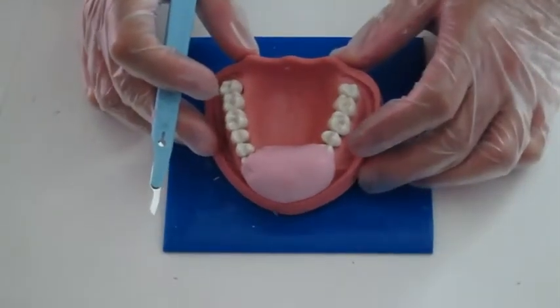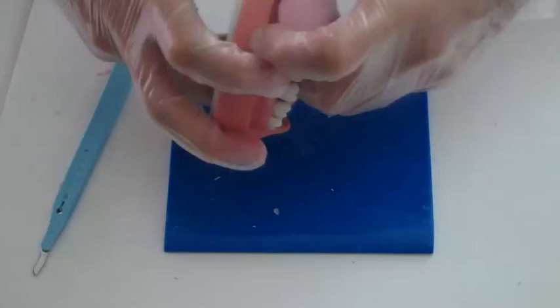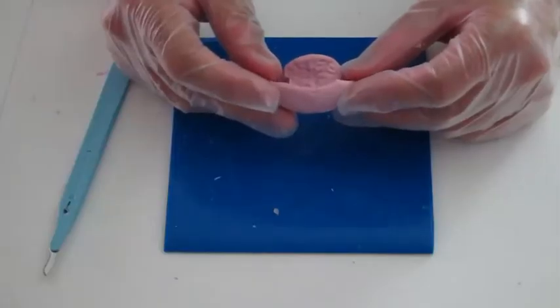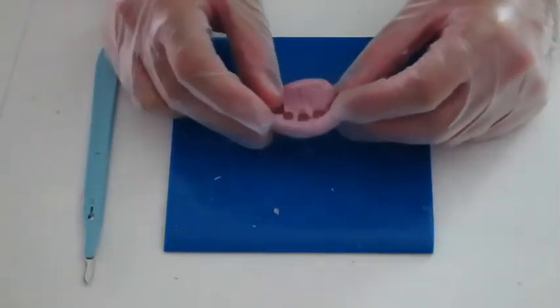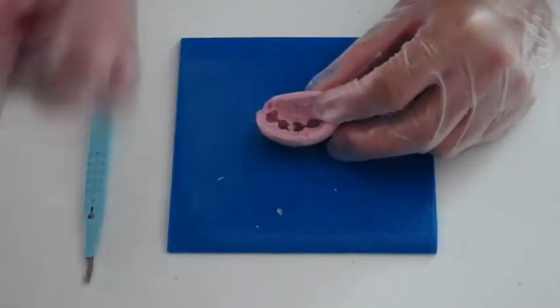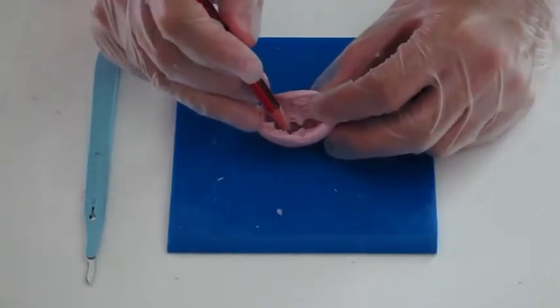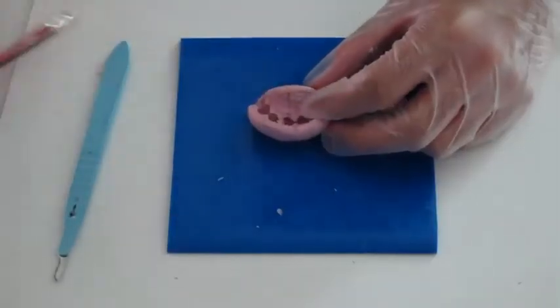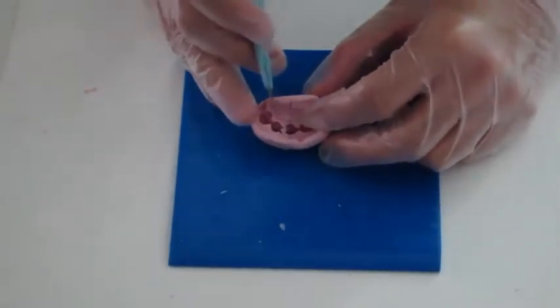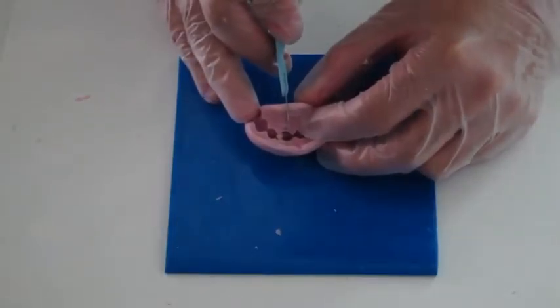After three minutes, the silicone index is completely set. I then take it off from the model. Next, I'm going to cut the index in half. You can use a pencil to draw the midline of the targeted tooth on both the facial and palatal surfaces of the index, then use the surgical blade to cut the silicone index in half.